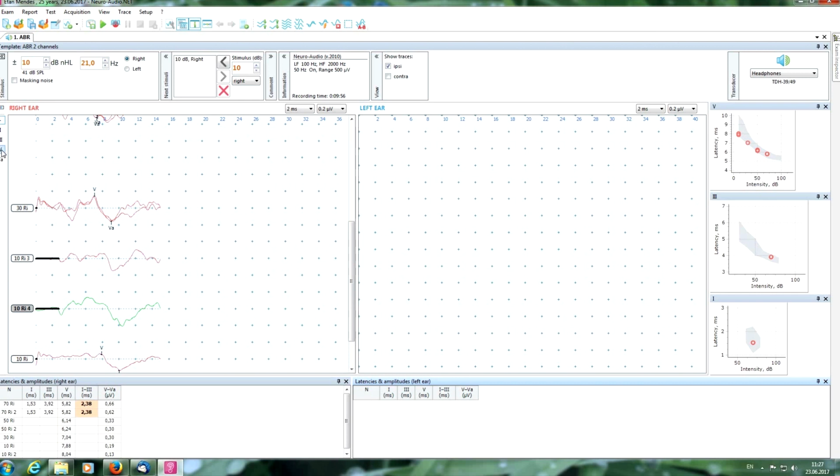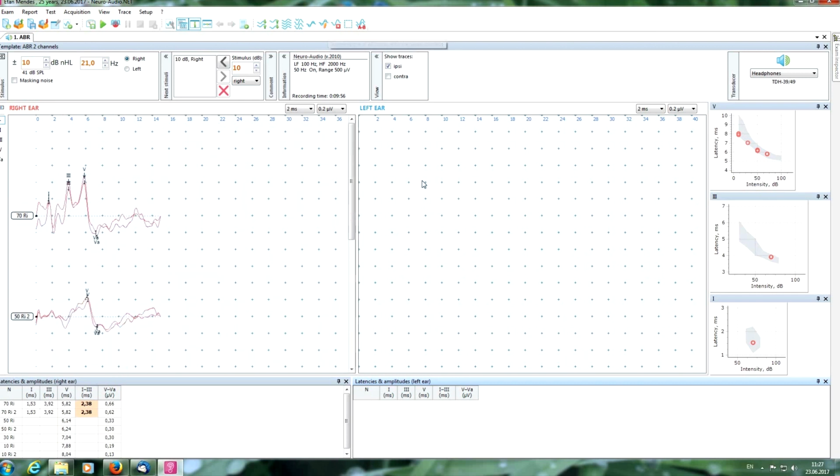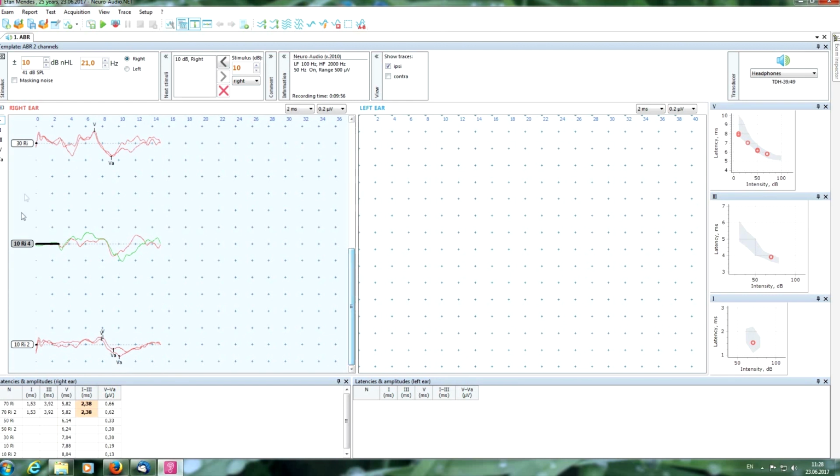Put the markers, overlay, amplitude enough. So we have a patient with normal hearing. Also, you can repeat the whole procedure on the left ear.